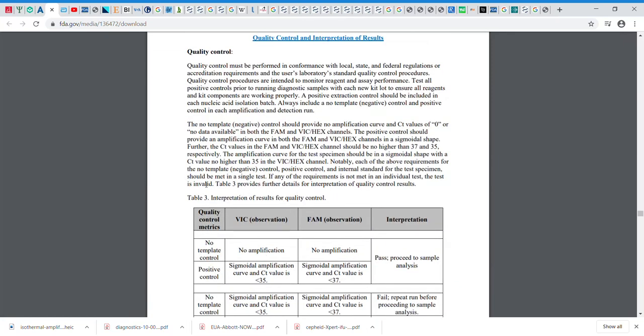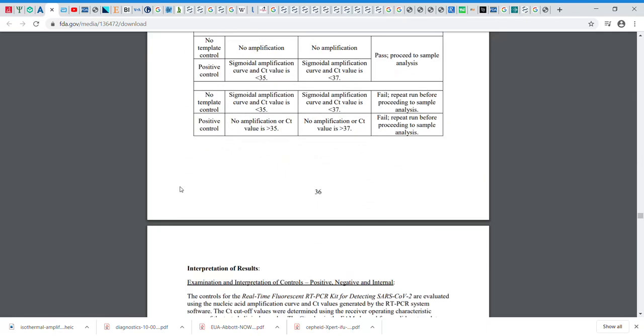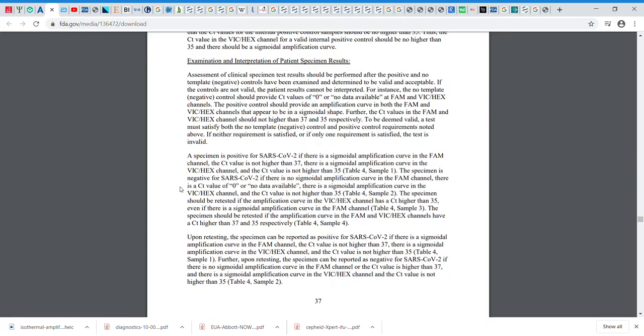And finally, they talk about quality control. These labs have to perform their own quality control. See, with a kit in the field, like the Abbott kit, you just sort of use it, right? You presume they've done their own quality control. In the hospital, you'll find that they actually have to do quality control. All the instruments, like the blood pressure cuffs and all that stuff, there has to be quality control. People have to check on it every now and then to make sure it's valid.